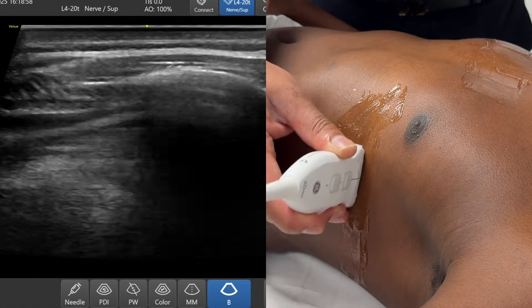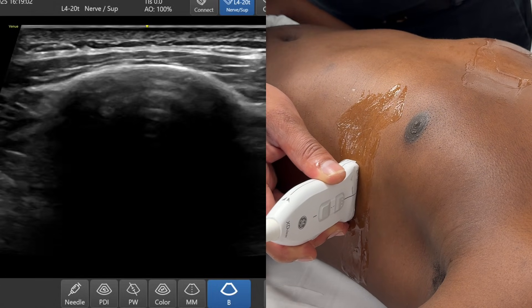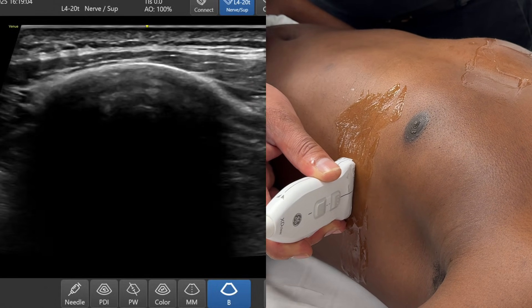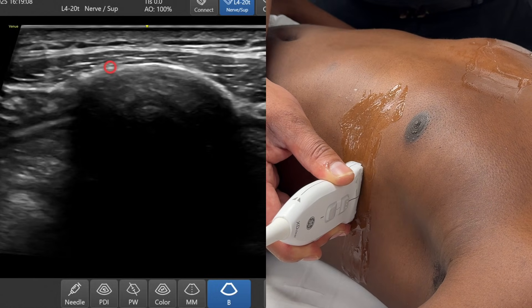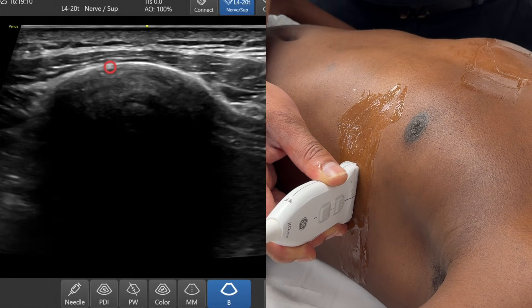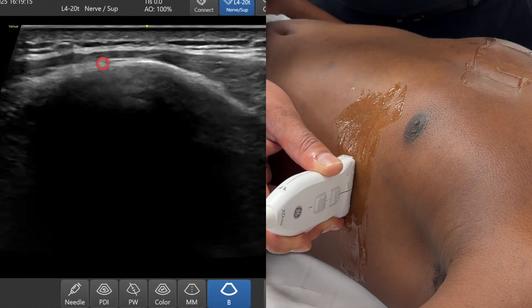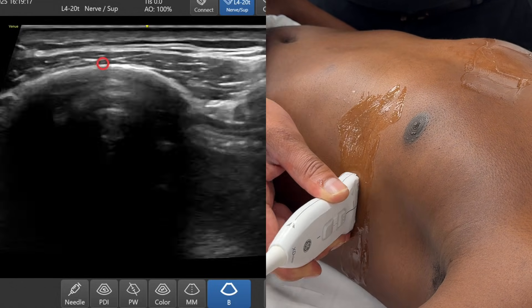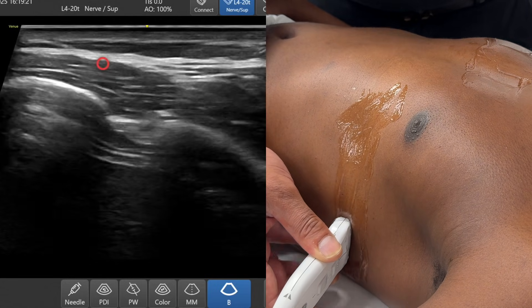I'm going to place the probe literally over the side of the chest. The first thing I want you to appreciate is a very obvious shadow — a bright white line with a dropout artifact below that. That's rib. There's a thin sliver of muscle on top of it, which is likely to be one of the slivers of serratus anterior. I'm going to keep sliding the probe posteriorly.